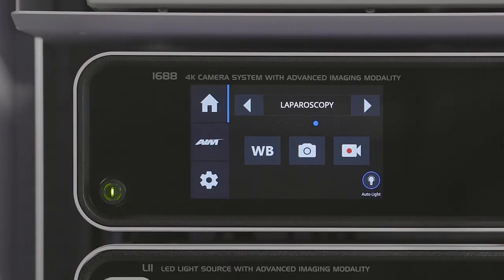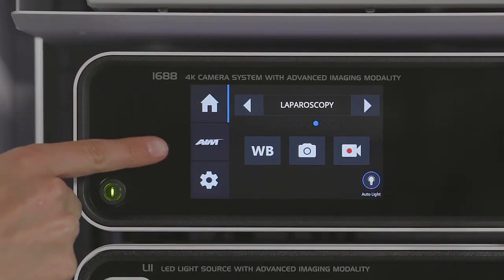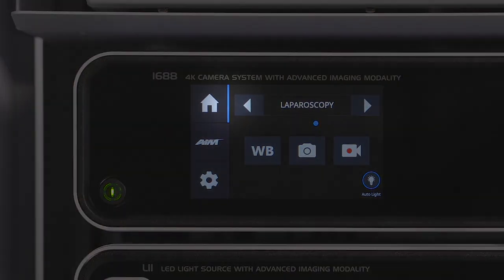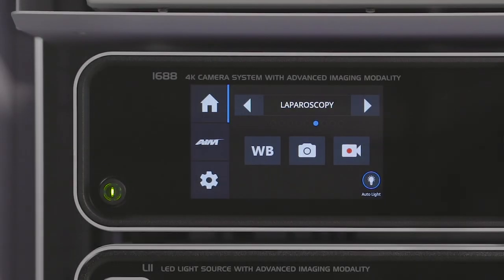The touch screen interface provides access to menus and controls for adjusting or capturing the video image. The navigation bar appears on the left side of each screen. The blue line on the icon indicates which screen is currently selected. Here we are looking at the home screen.